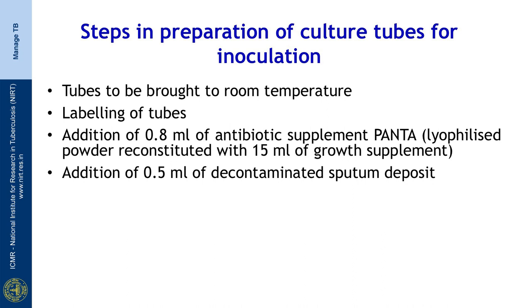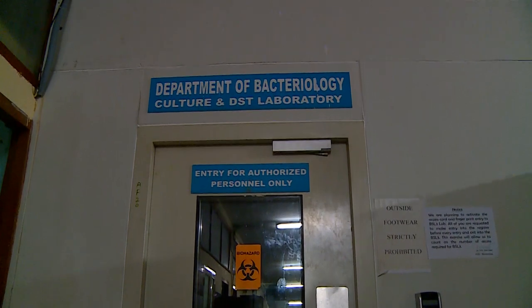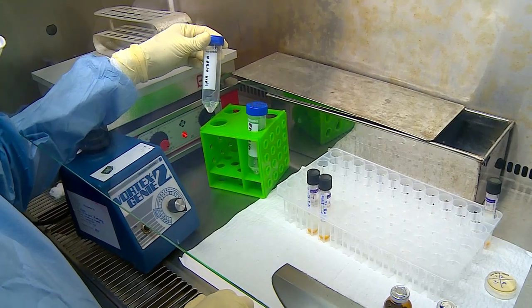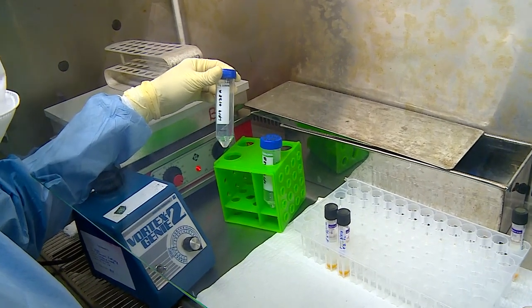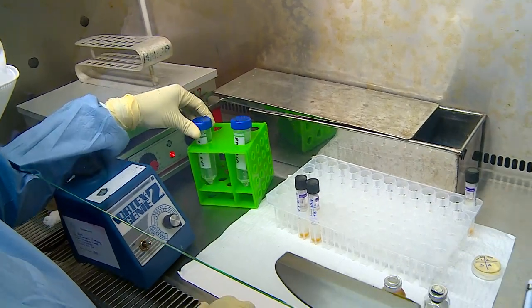We shall now see the demonstration, which is done in the biosafety level 3 laboratory. We have 2 deposits from decontaminated sputum specimens which have to be inoculated, and 2 MGIT tubes have been brought out to room temperature.